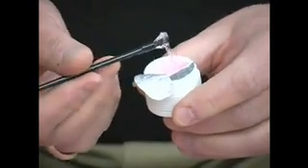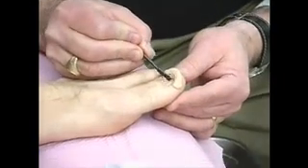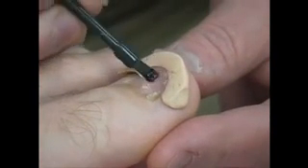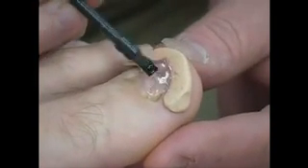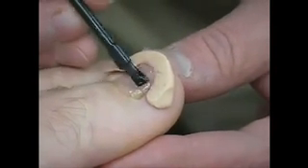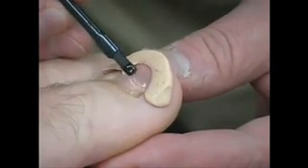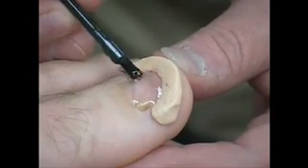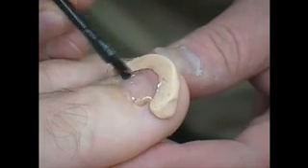And these are all single use, so they're all sealed. When you unseal this, it is a resin, and while the light is key on hardening, this idea that you close it, you save it, you use it later, forget it. Once you unseal it, it's done. So it's a single time use, but you've got more than enough time to get it through for 24 hours without a problem. It's also nice with a patient that they see you open it right in front of them. You peel that top off and they know there's nothing else dipping into that thing. That's their bottle.